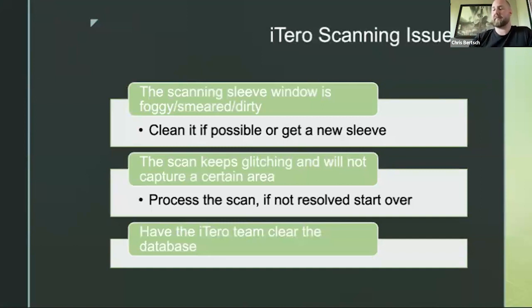If not, sometimes I have just restarted, because the other thing with the iTero is that it's taking images over images, which is going to distort what you finally want. If you're doing a crown prep and taking a lot of scans, your accuracy is going to be shot because it has so many more images layered on top of images. Same with dentures.